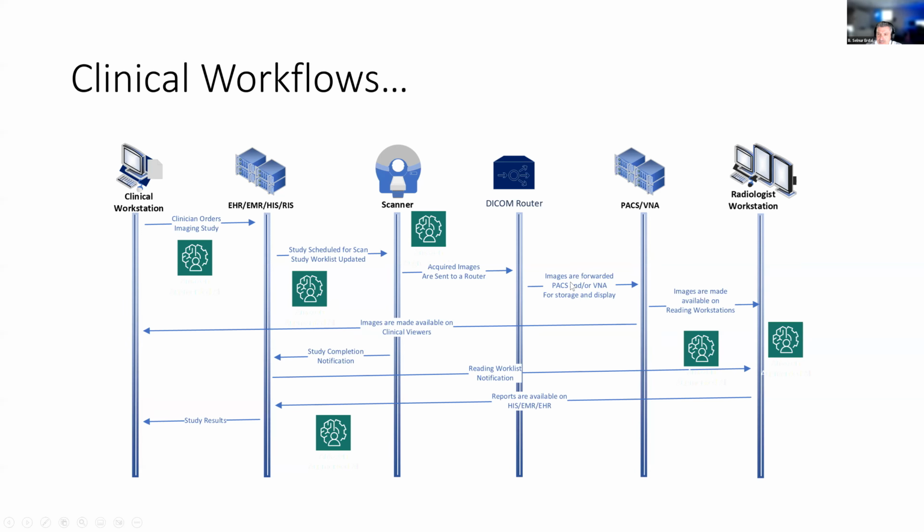As soon as it is detected by the algorithm, whose input would be a DICOM study but whose output would be an HL7 or some sort of message triggering the reading work list, it would alert the physician saying, can you please take a look at this? We think there's an emergent case here. It would prioritize that exam on the work list.